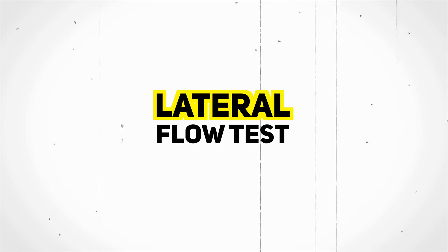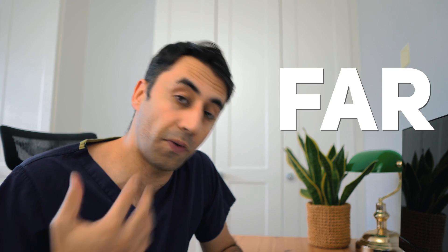Welcome to this quickfire video on how to do a lateral flow test. Remember, if you've got COVID symptoms, you have to get a PCR test, which is far more accurate.